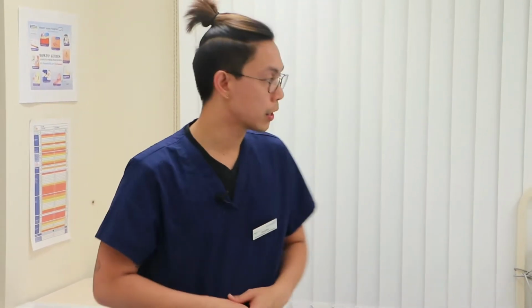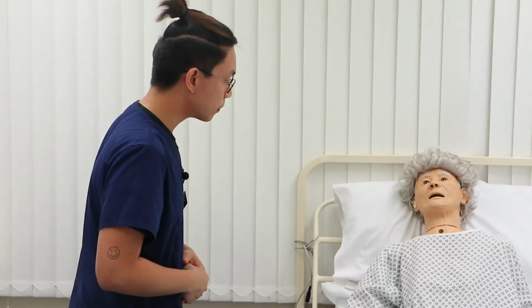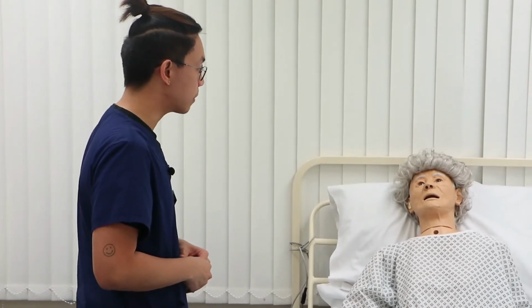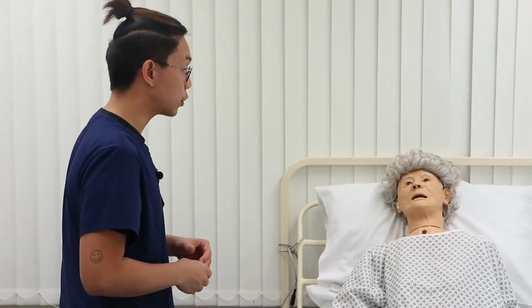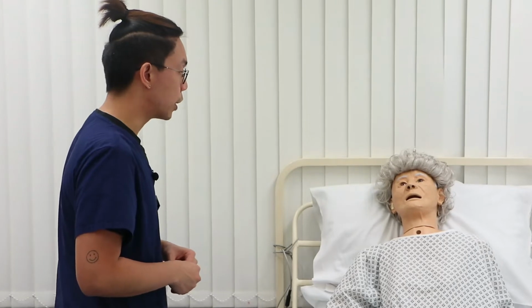the procedure. So, hello, what do you want to be called? You can call me Catherine. So, Catherine, my name is Christian. The reason I am here is I'm going to do a procedure called your midstream sample of urine collection and urinalysis. So, this procedure is done for us to check if there are any signs of infection or any abnormalities in your urine. This procedure involves me taking a sample from you, which is your urine.